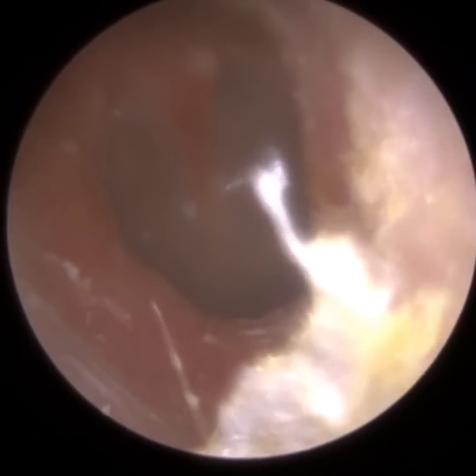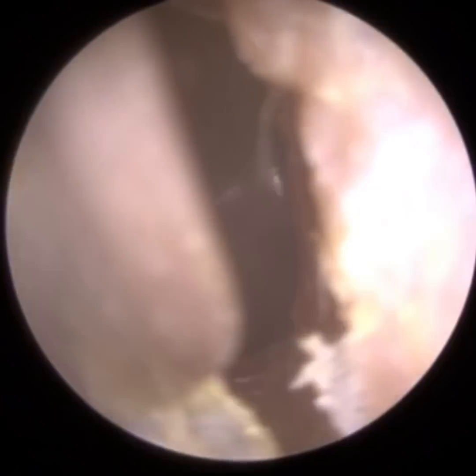You can just see the eardrum there, and a bit of dead skin that I'm going to peel now using a fine end suction probe.